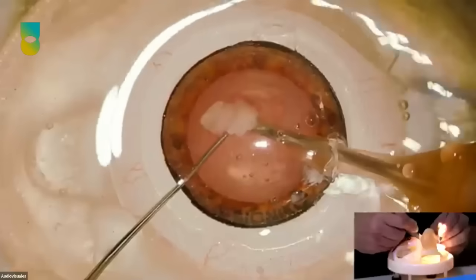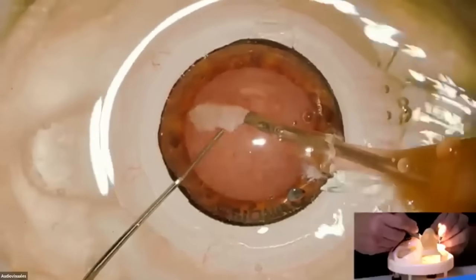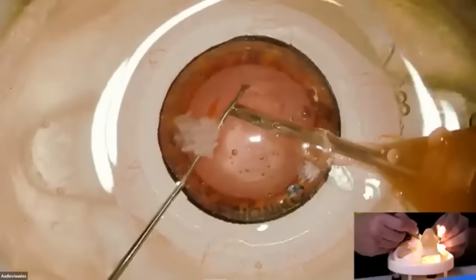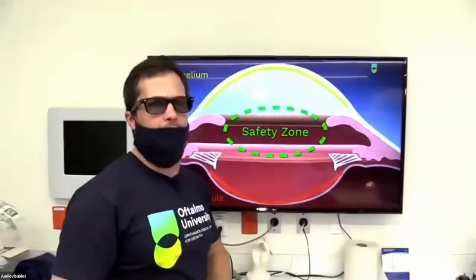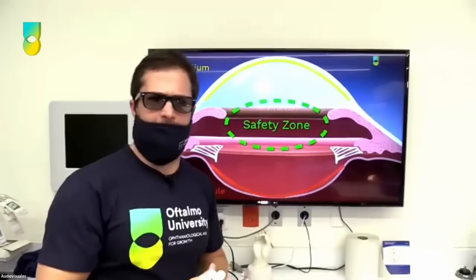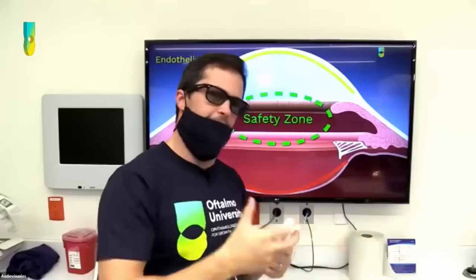Congratulations. Let's come to this concept. I think Cecilia said it very well. Let's see if you can see this camera. I'm making Lisandro work a lot today on the safety zone, guys. Cecilia was saying, go to the loose fragments, take them to the center. There's something called the safety zone, and we can practice this in 3D. It's a 3D area, right?